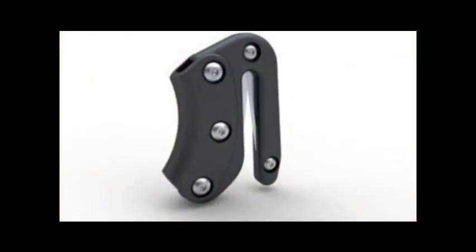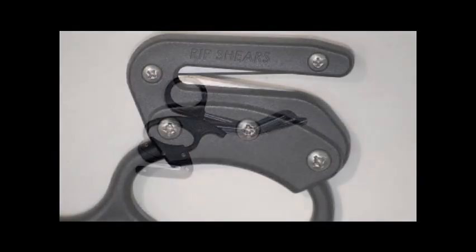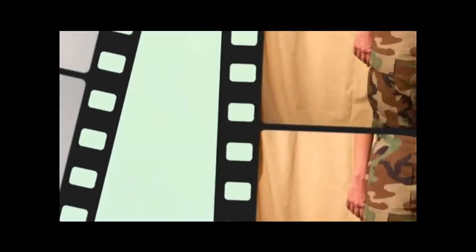The RIPPER unit is 100% made in the USA and will bolt onto any standard set of 7¼ trauma shears. It uses replaceable blades made from 440A surgical grade stainless steel.